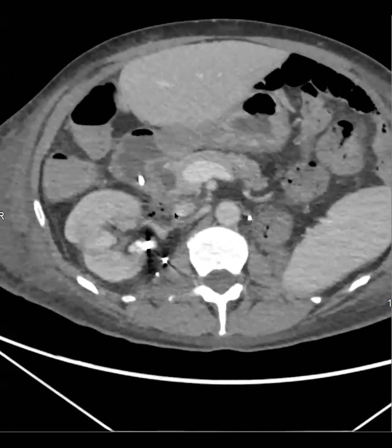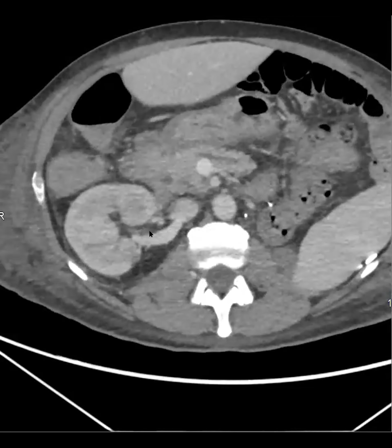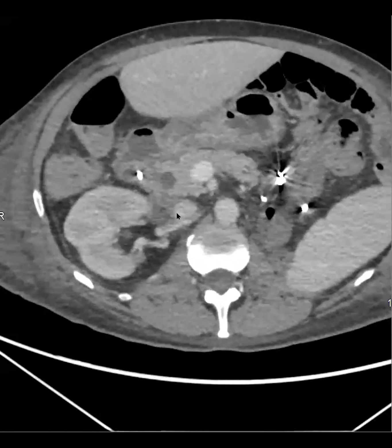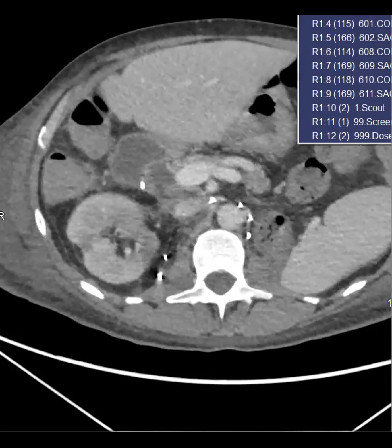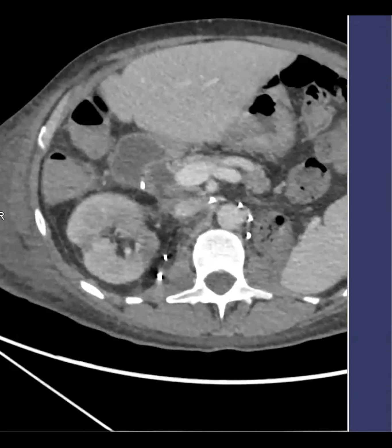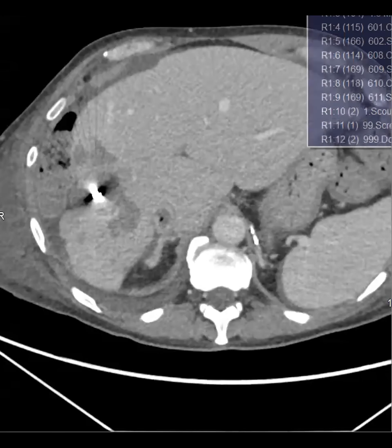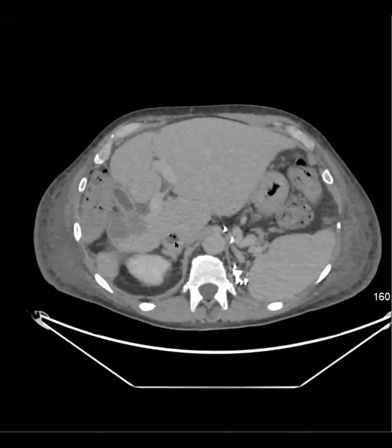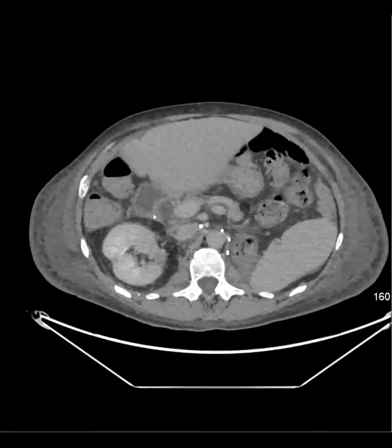I don't know, it's unclear, when I look through the chart, why he had the perforation, what predisposed him to it, but they ended up putting a stent and they did an angio to clear out some of the clot, relatively successfully, because he was better on a follow-up study, which somehow, oh wait, this is the follow-up study. Sorry, I pulled up the wrong one. Here's the original one, where you can see the clot even better. And again, you can see all of this. Wait a second, where's the subsequent one?